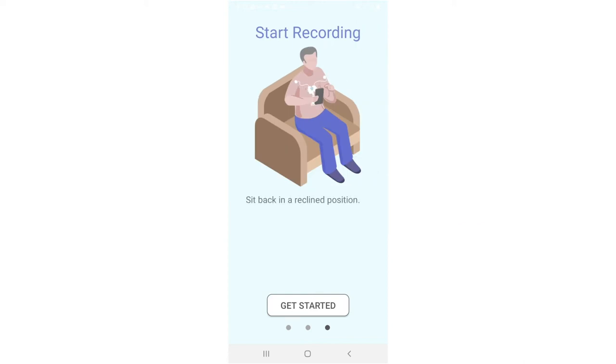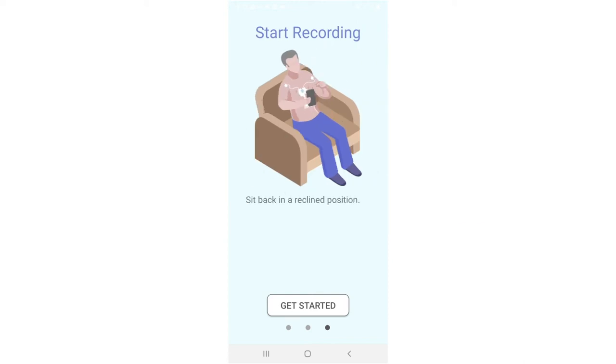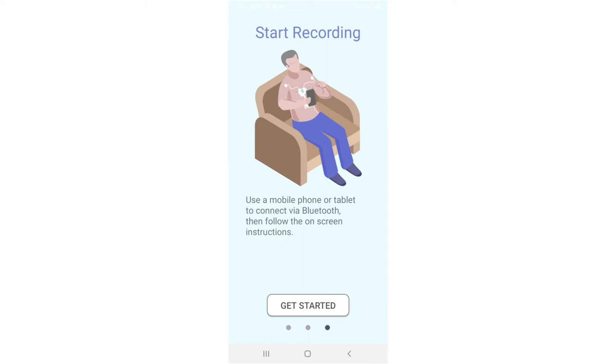Start recording. Now, sit back in a reclined position. Relax your muscles. Use a mobile phone or tablet to connect via Bluetooth, then follow the on-screen instructions.